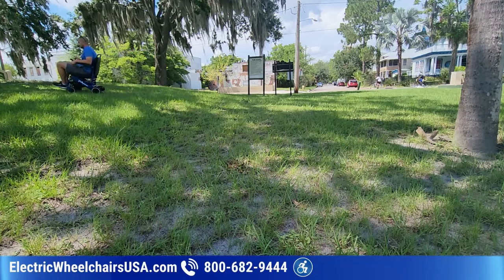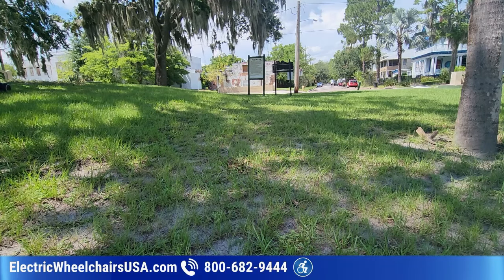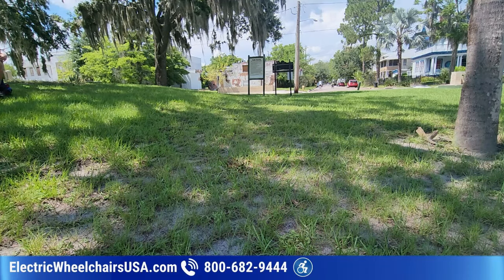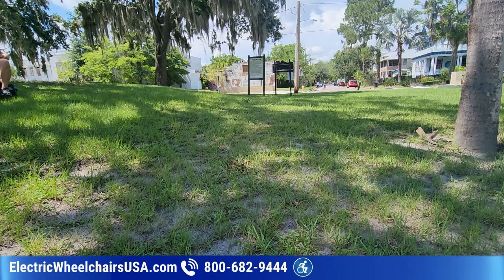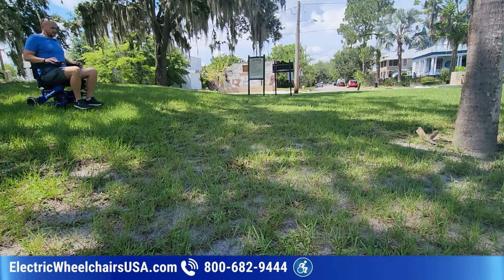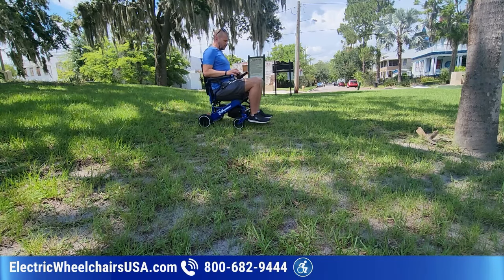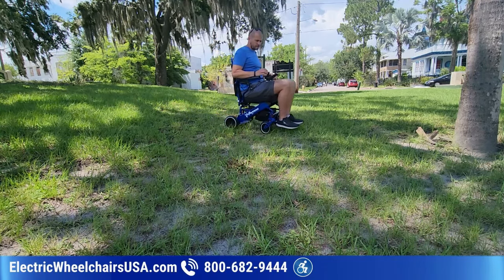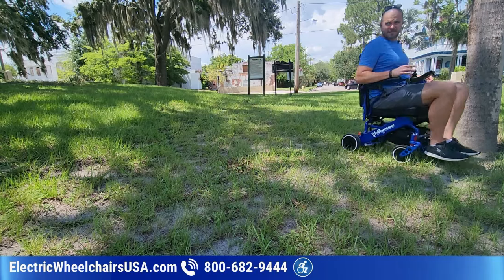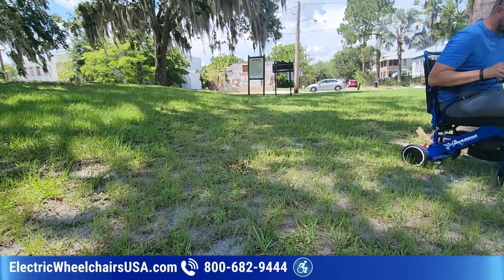So it made it up the hill. Wasn't graceful, but it did go up the hill. Now, same thing with going down. Going down's fine. You want to lean back a little bit, but let me try another part of the grassy terrain over here.